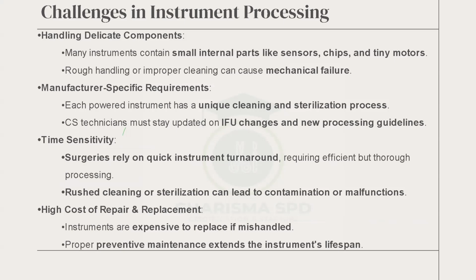Challenges in instrument processing. Handling delicate instruments. How do you handle somebody who is delicate? You have to go with care and love. You have to give it all your attention, because if you are absent-minded, something will happen.